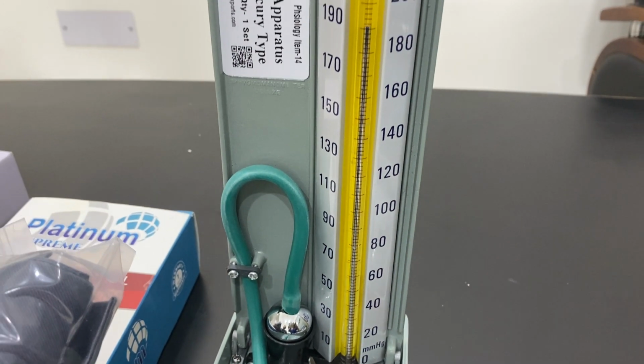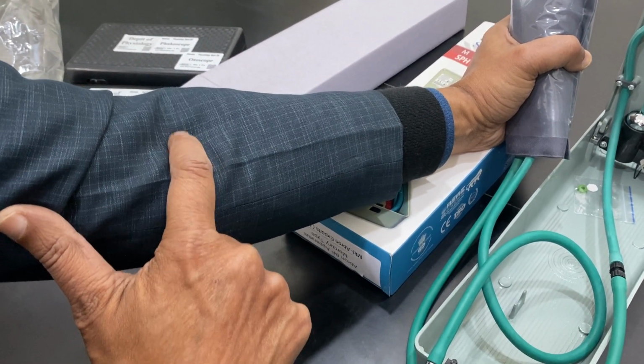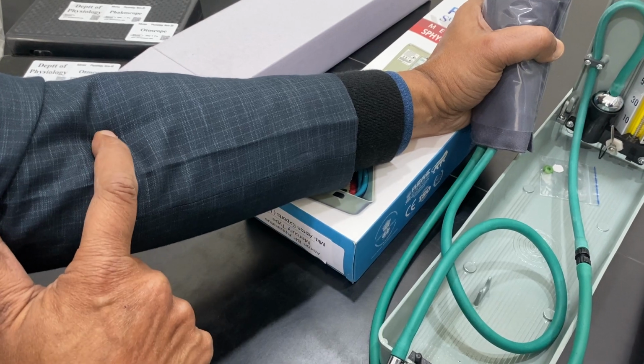And when you have to check the BP, see this. Here is an artery, as you doctors and everybody knows in the teaching colleges. I am just teaching it for institutions or the new boys and children who do not know how to use a BP apparatus in the home.